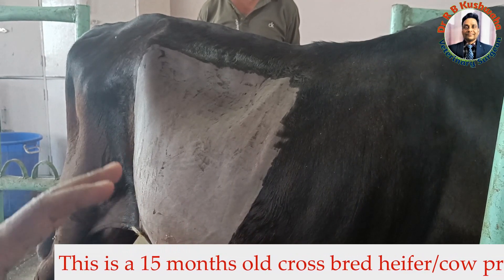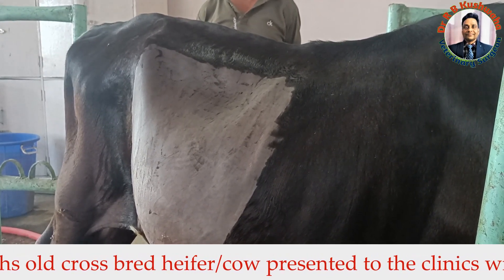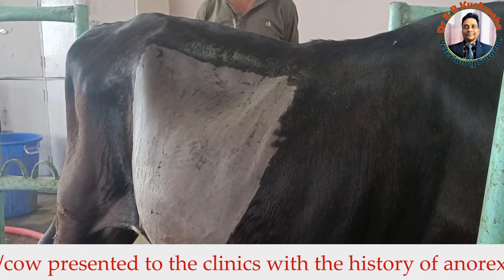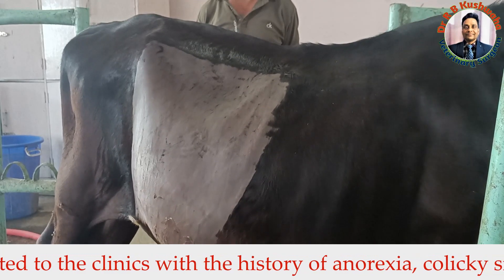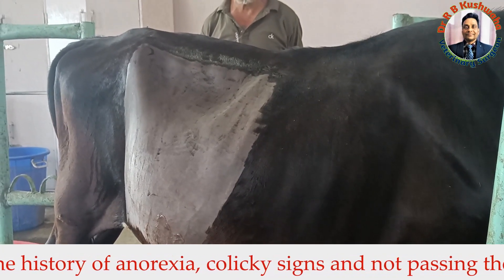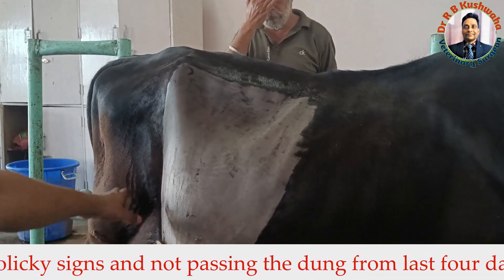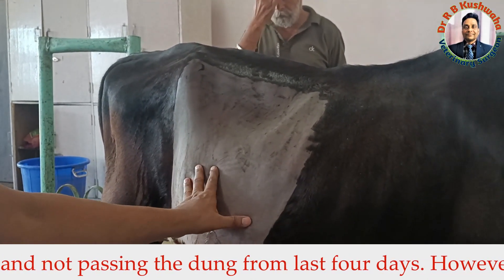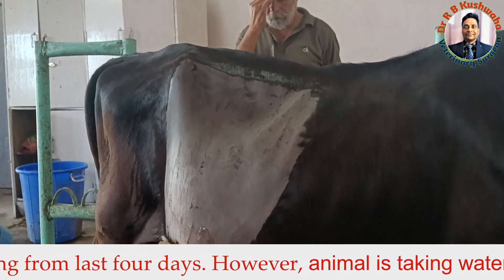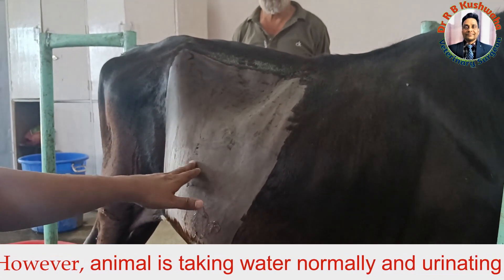Although the animal is urinating normally and drinking water. If such signs are present in a crossbred cow, we suspect intestinal obstruction. Since the incidence of intussusception here is very high, we are suspecting intussusception. I performed a rectal examination, but nothing was found up to that area. Probably the intussusception mass is located ventrally and cranially, which is why the hand could not reach that level.